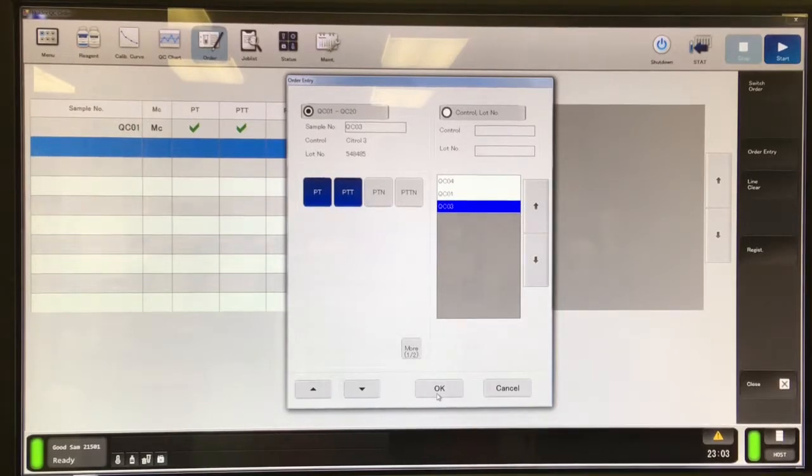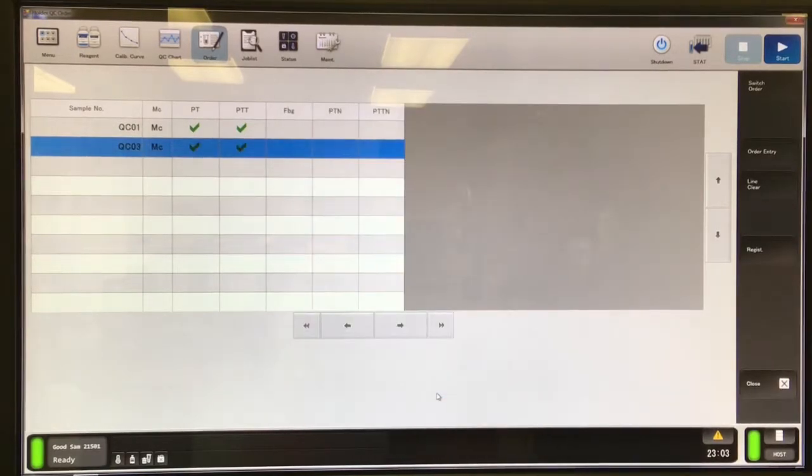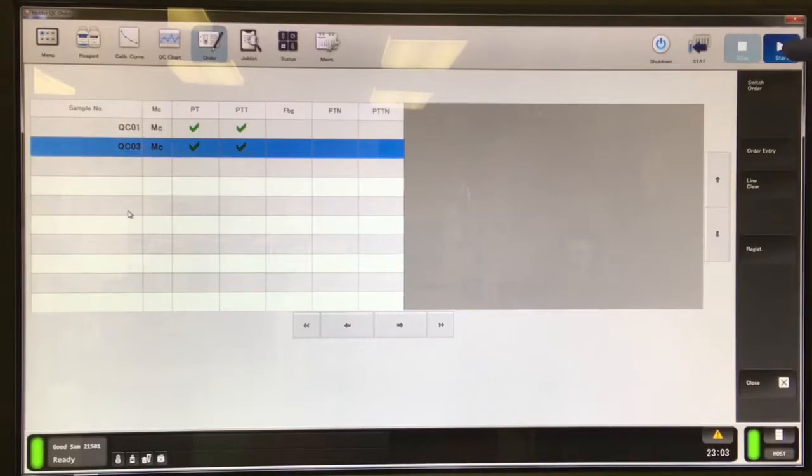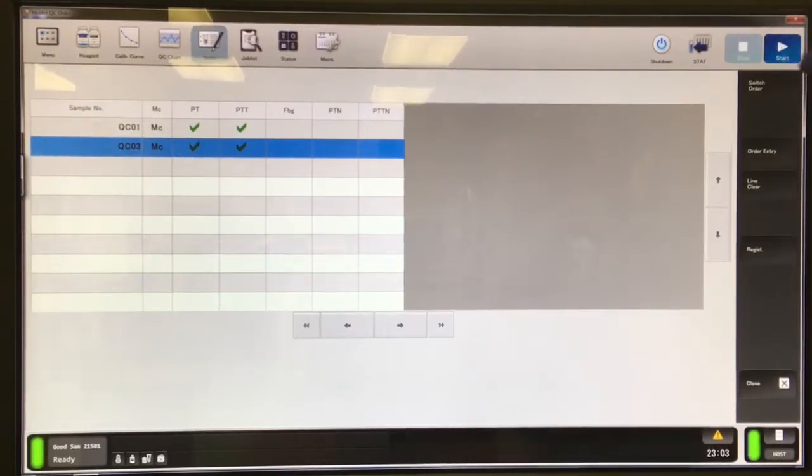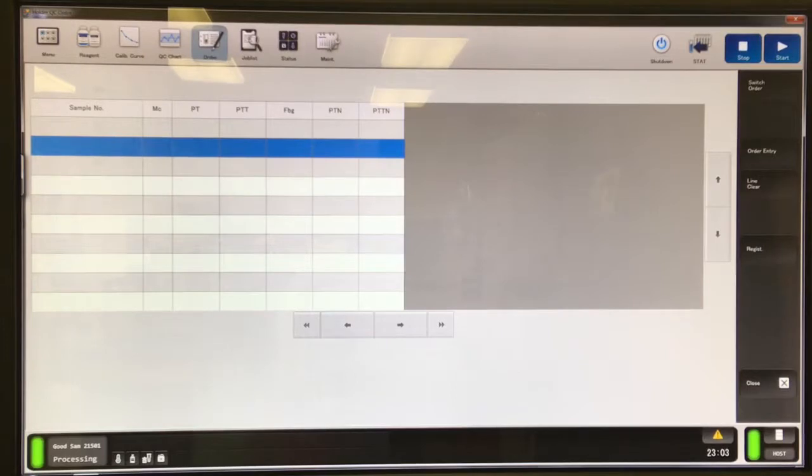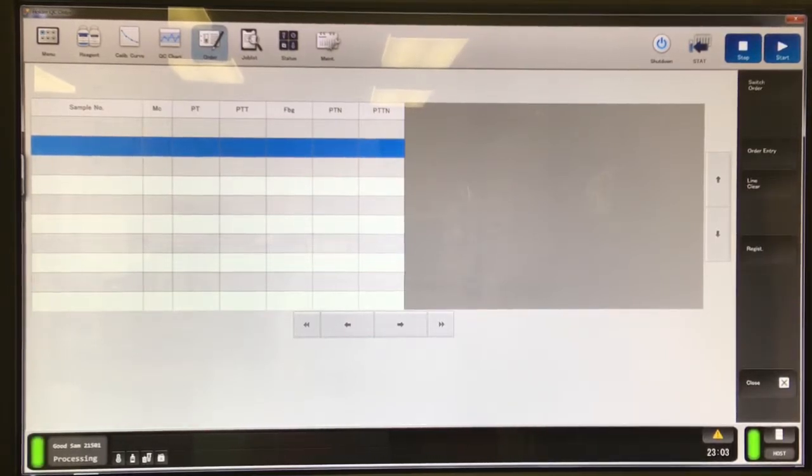If you're going to keep adding other QC tests instead of hitting okay, just keep hitting the down arrow and it'll keep going into new blocks. If you're done though, just hit okay, and then from here, hit start to get your QC running.